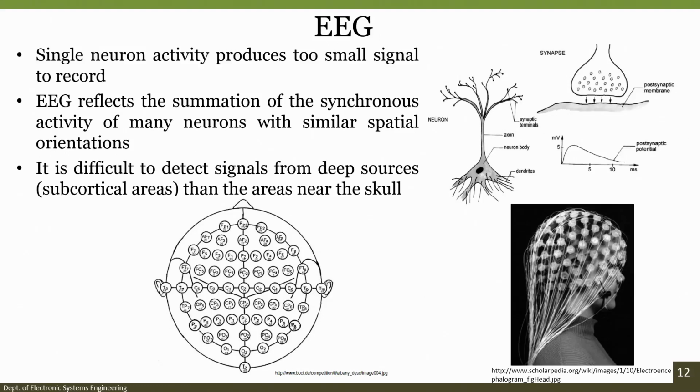We discussed in previous modules what the frontal lobes, occipital lobes, parietal lobes and temporal lobes are. We also discussed the 10-20 system, so that there is uniformity in the placing of the electrodes, immaterial of the size of the brain or the head size.